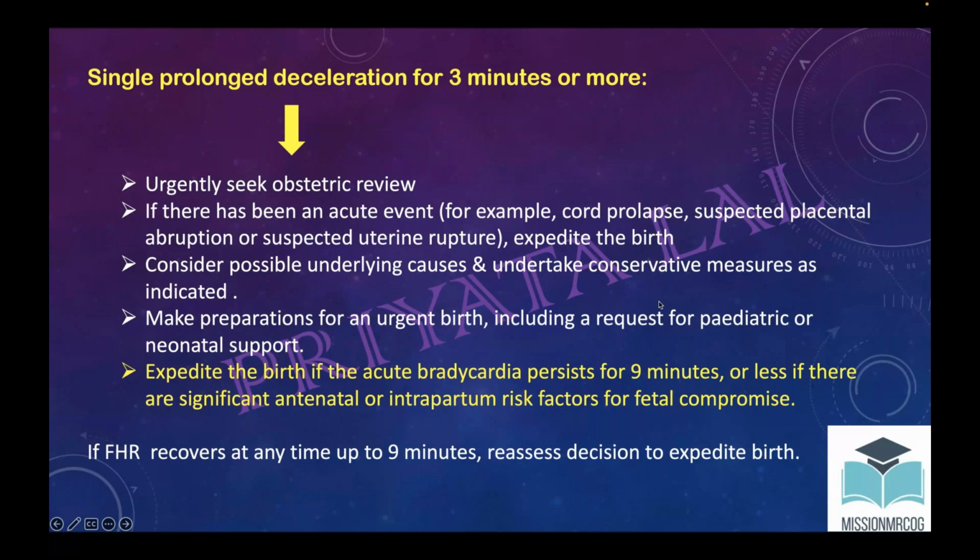If the acute bradycardia is still there even after 9 minutes, then we have to deliver the baby. But if the fetal heart rate recovers by 9 minutes, then reassessment is to be done, whether we can still go ahead with the labor monitoring or whether expedition is required. This is the same as in the previous guideline.